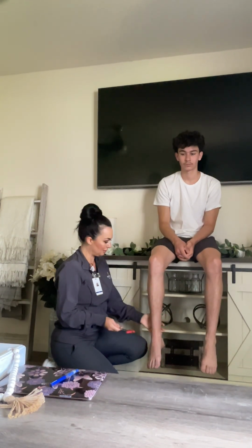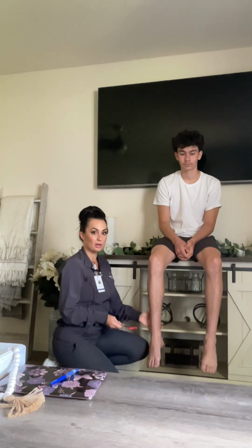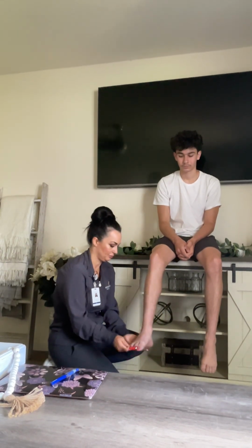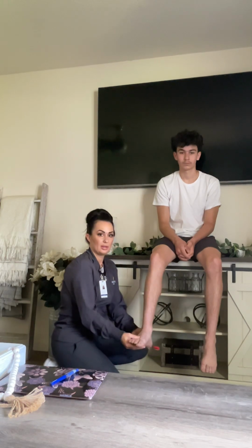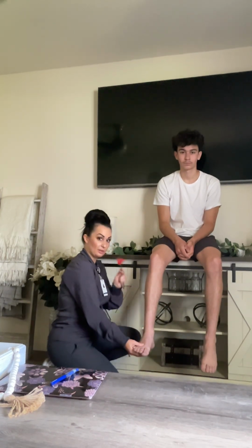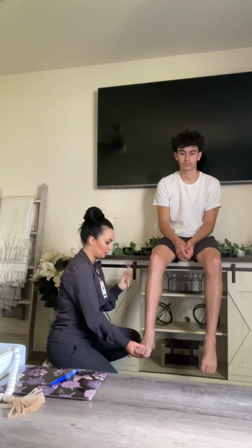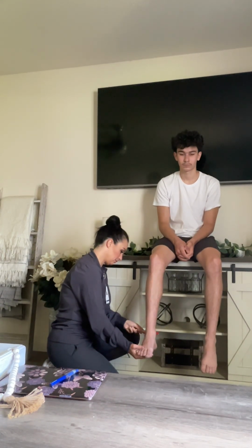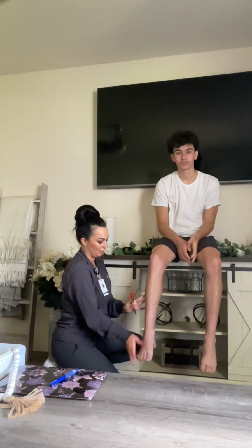Next, we're going to go to the Achilles tendon. Again, his leg still needs to be relaxed for this as well, and dangling. I'm going to support the foot. And then I'm going to tap the tendon using the flat end of the hammer, which is the back side of it here. Perfect. A normal response is meaning the foot goes a little forward, which we did see that.